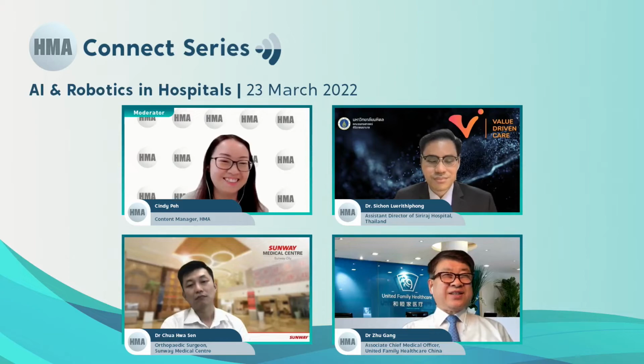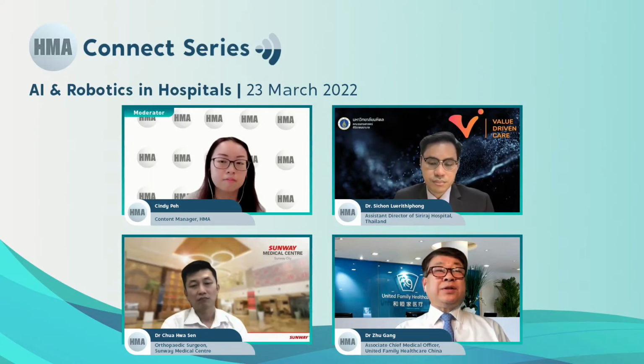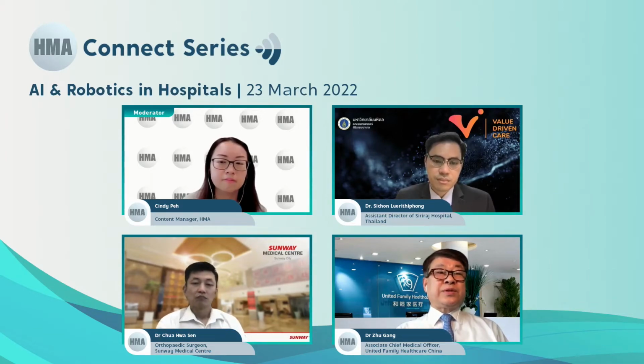That is quite a challenge, difficult as well. With my experience, and it has also been reported in the literature, robotic surgery can finish more complex surgeries. Previously, for kidney tumors, you had to remove the whole kidney, but now we find that we don't need to remove the whole kidney. We just remove the tumor, because we can achieve the same oncologic control and the patient can live longer. They can also reduce acute kidney failure as well. So there are a lot of advantages of robotic surgery.